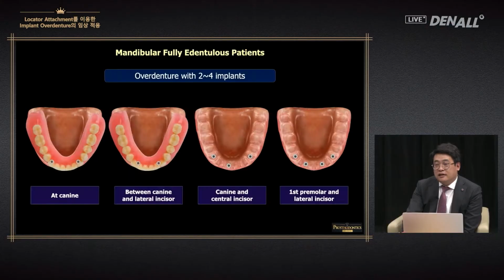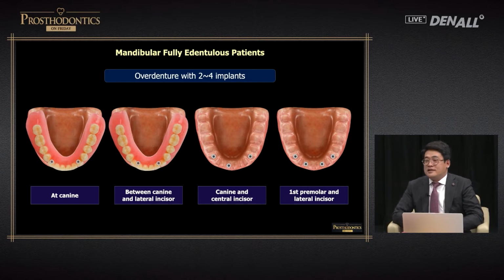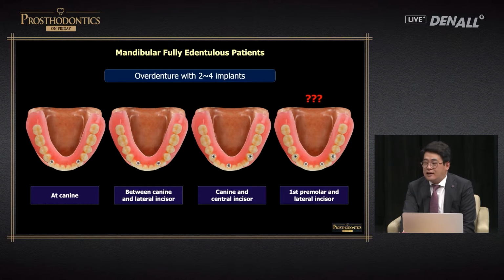At times, 4 implants are placed for overdenture. Overdenture using 3 implants, I don't think this is placed intentionally. Maybe the dentist placed 4, but 1 failed. There are cases where people place 4 these days. It's not really done this way because even dentists are divided over implant overdenture. Some people did test it. The process is too complicated and it's uncomfortable, and maintenance-wise, it's not very good.